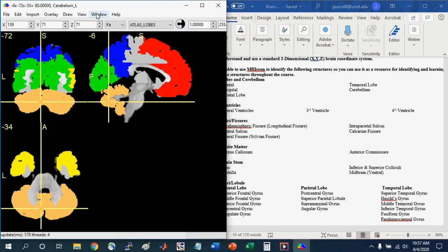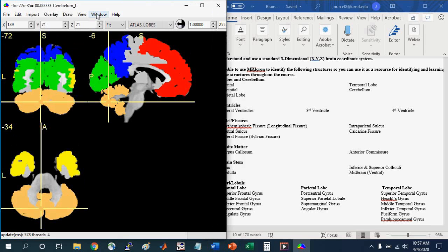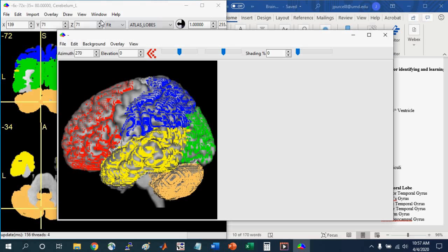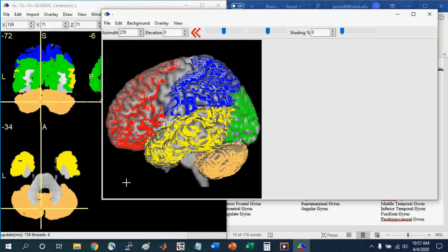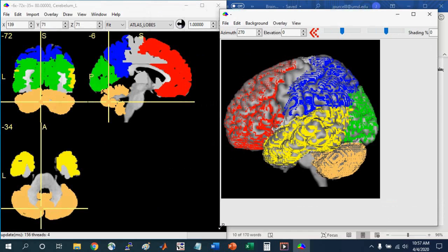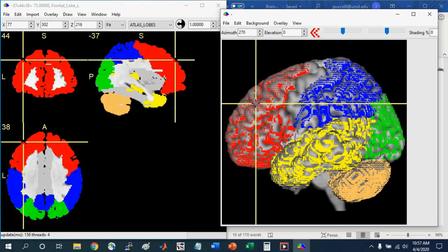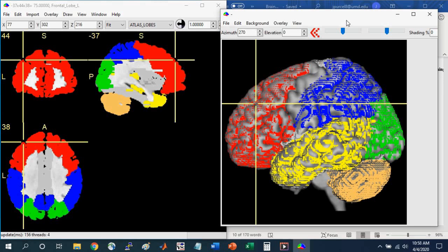To help you do that, you can also use a 3D rendering tool. So you can go to Window, Render, and here you see a 3D projection of this brain with the colors on top of it. So you can see this red area here. If I left click on the rendered view, it jumps to the surface in the slice view. And so you can see in the sagittal, coronal, and axial views, you can see where on the surface of the brain it is.